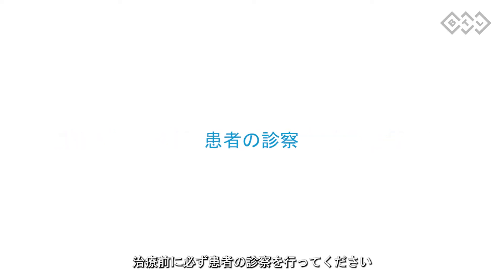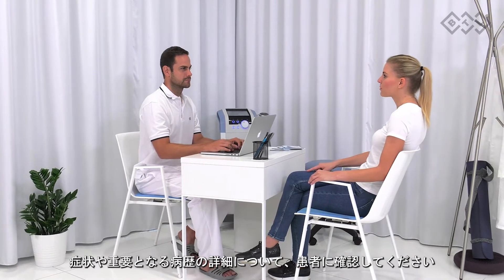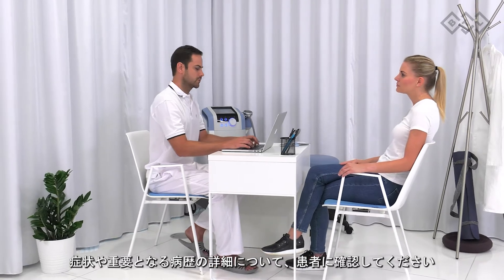Prior to the therapy, it is necessary to start with a patient consultation. Ask the patient for a detailed description of health problems and inquire about the most important points in anamnesis.